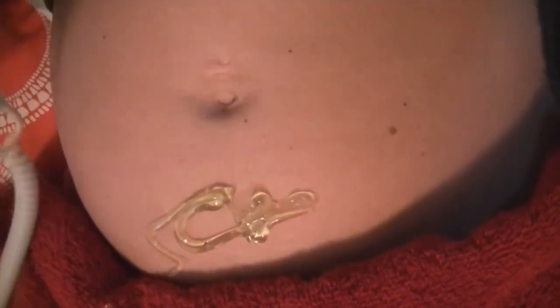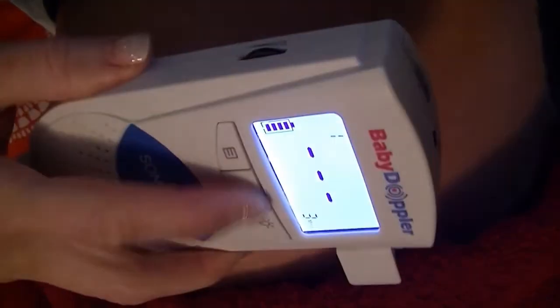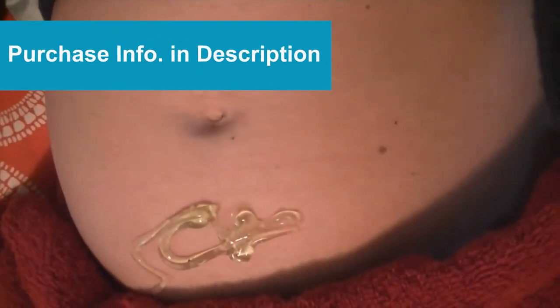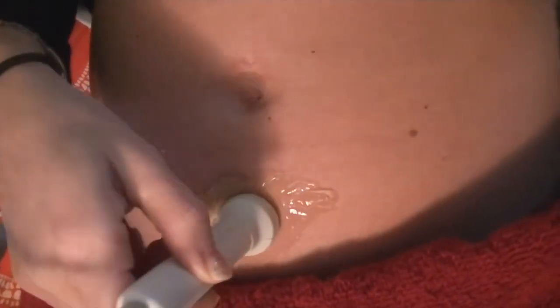is you want to turn on the Doppler and turn the volume all the way down at first. Next, you'll grab this part, and what you'll do is plant it into the gel and kind of, I don't know what this word is, but dabble it until it's evenly coated. At this point, this is when I turn up the volume so that way I can hear.